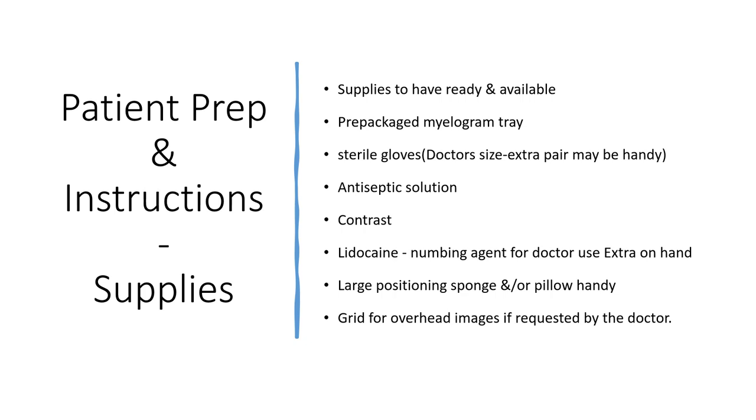A large positioning sponge or pillow may also be handy. The pillow you want to place underneath the abdomen to create a little hump in the back. And a grid for overhead images if the doctor requests.